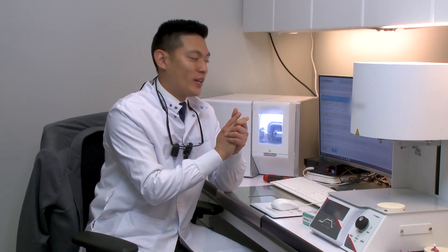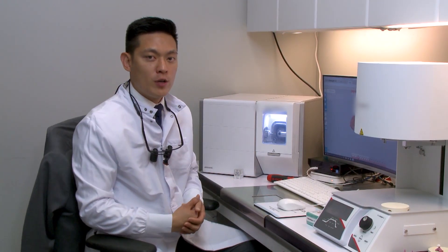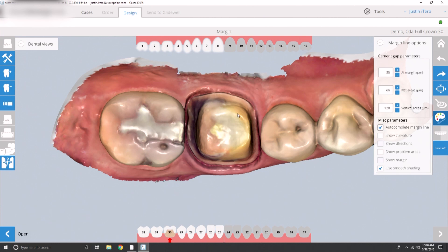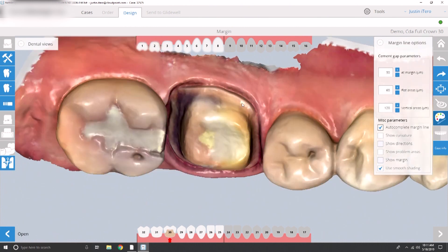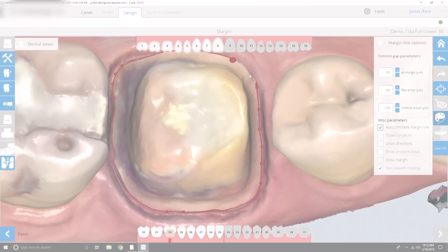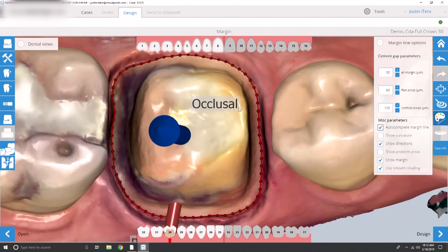We're in our lab. We have our chairside workstation, our design station, and our milling unit. I'm going to open the file we just transferred over from the digital impression system. Now that we're in design, I'm using the mouse to control the rotation and zoom of the preparation. I'll start off the margin placement — a single left click and you can see how the software begins trying to identify it. It's kind of an automated process, but the software has no idea where the margins are, so we need to tell it where to begin. This designates the start point of the restoration — it's so critical.